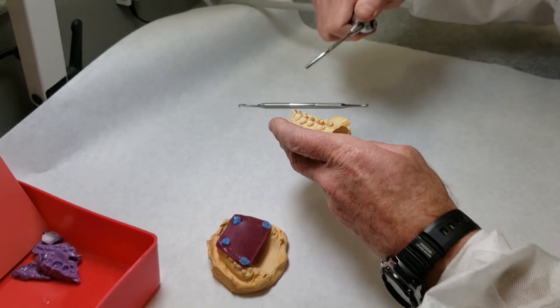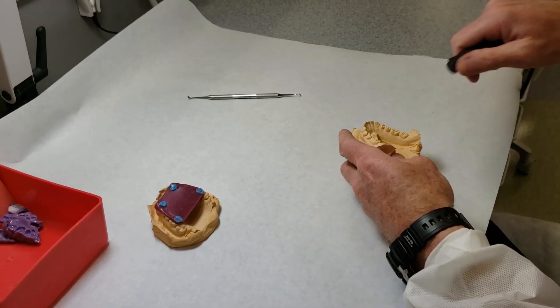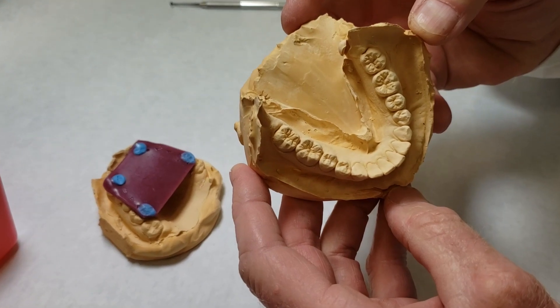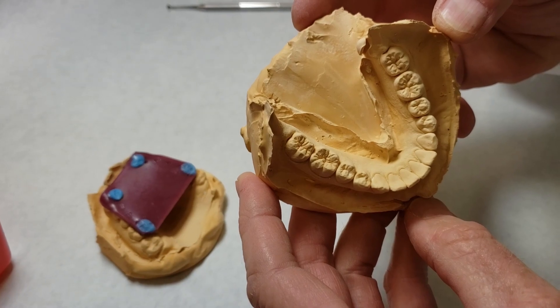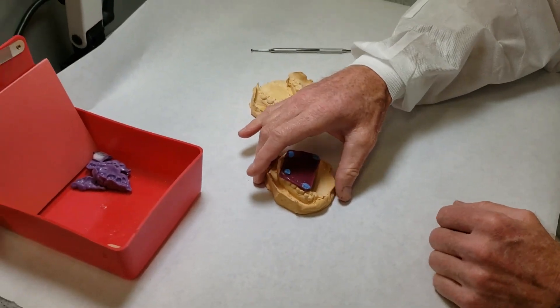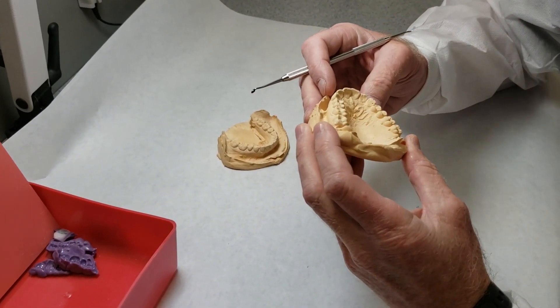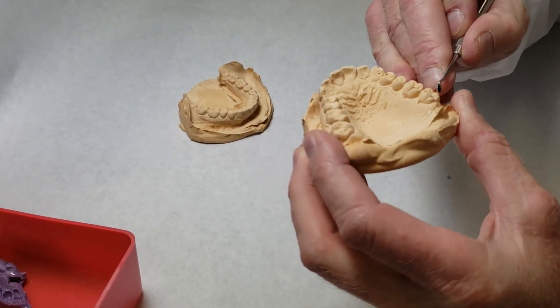Once you've got a good clean occlusal surface you're ready to trim your model. We'll go to the maxillary cast and do the same thing. Our maxillary cast has a few more imperfections on it than our mandibular cast, but we'll go ahead and get those off.